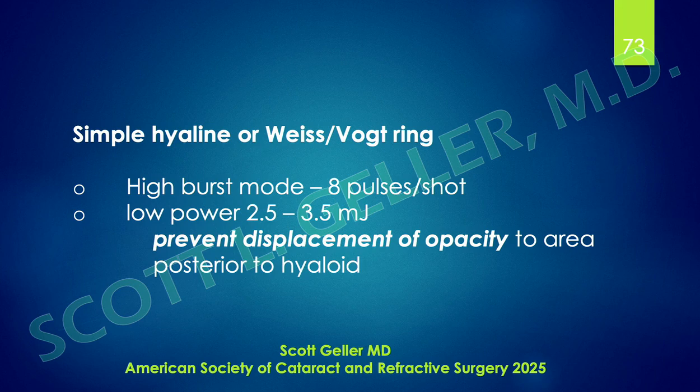You can go back and get that. You've got to jiggle the eye with the contact glass. Ultimately, you can get that. I've had that phenomenon happen to me several times. But the difference between an expert and an amateur is actually getting what you're going after.